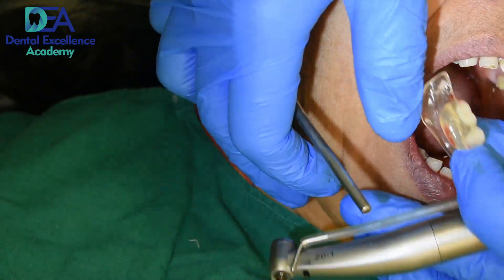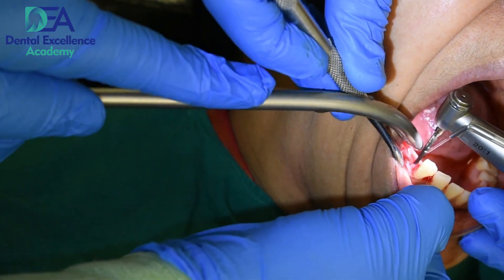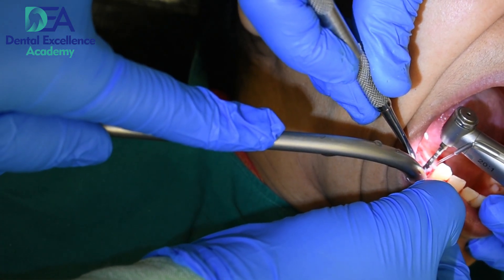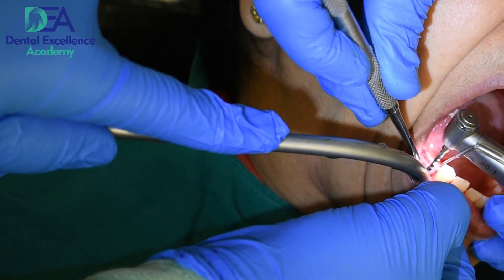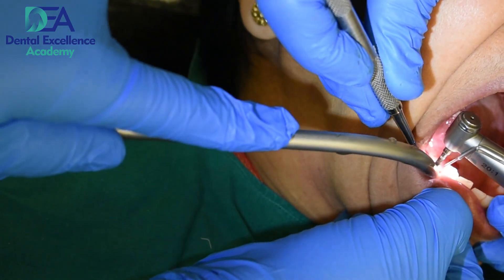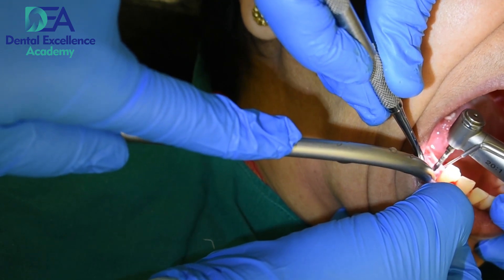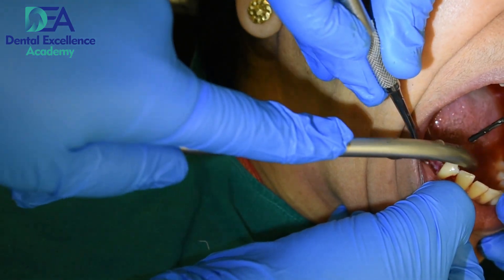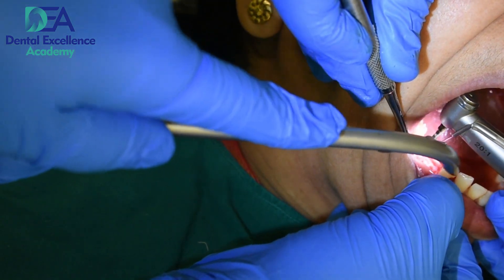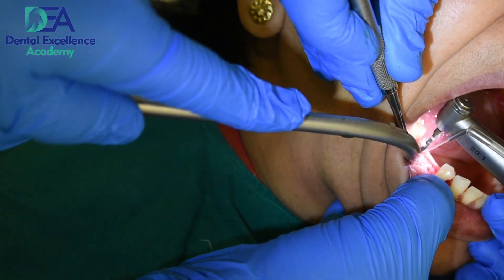If at all we are at the wrong place, we can change it. But we are exactly at the correct position. Because of the thin bone on the buccal side, I am keeping the drill more to the lingual — giving more pressure on the lingual aspect so that we can save the bone on the buccal side.